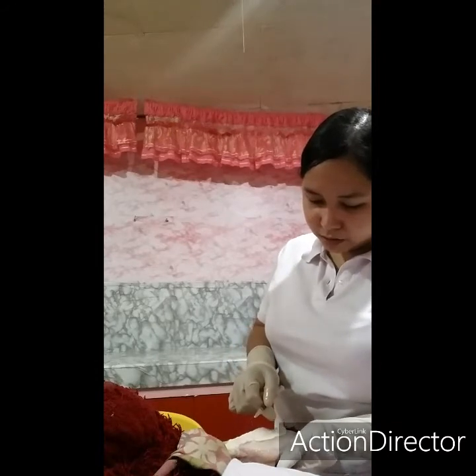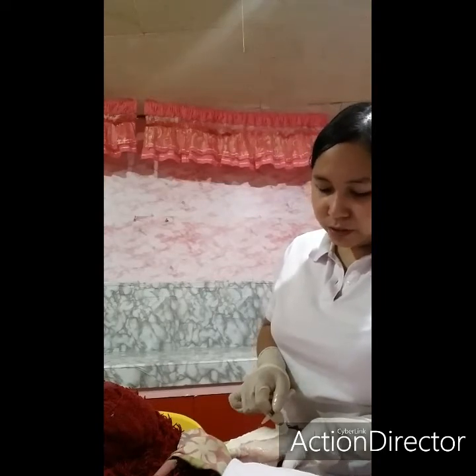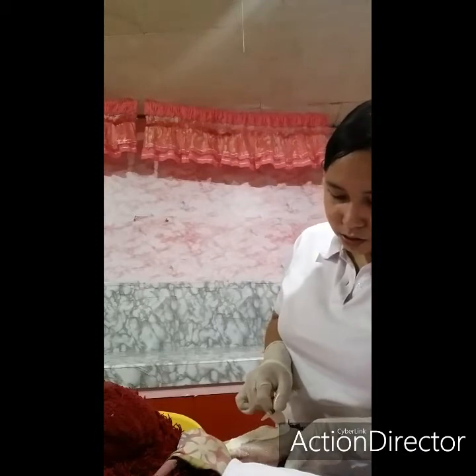Then slowly inject into the patient's skin within 10 to 15 degrees, just like this.